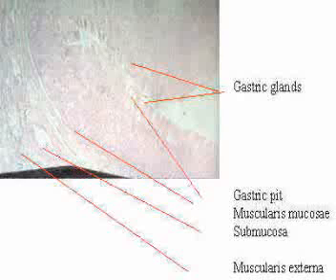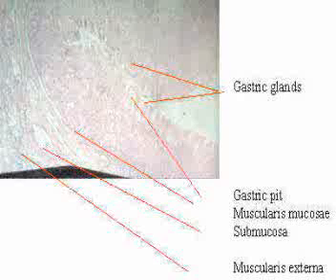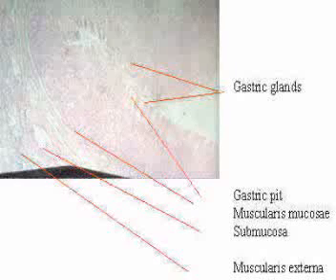Can be easily made out by its numerous gastric pits and its fundus.